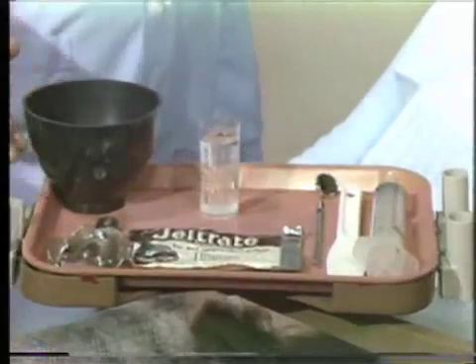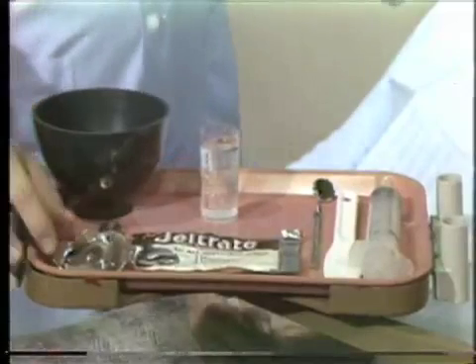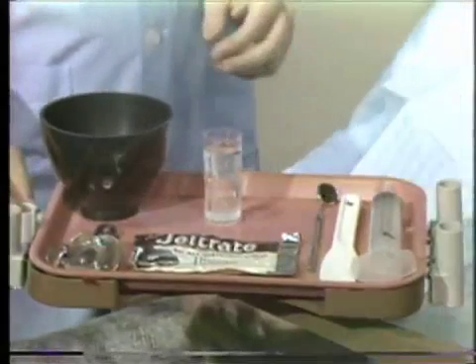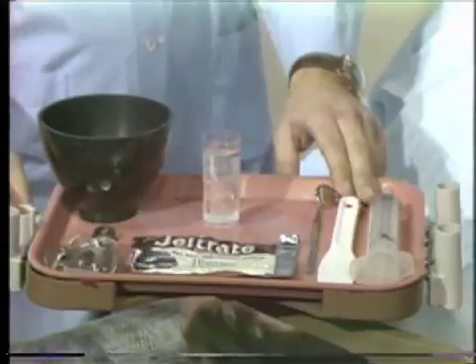The armamentarium for this technique includes a large flexible hygienic rubber bowl, a maxillary residual ridge edentulous impression tray, a 2-ounce BD irrigating syringe, and a Sphedia plastic spatula.